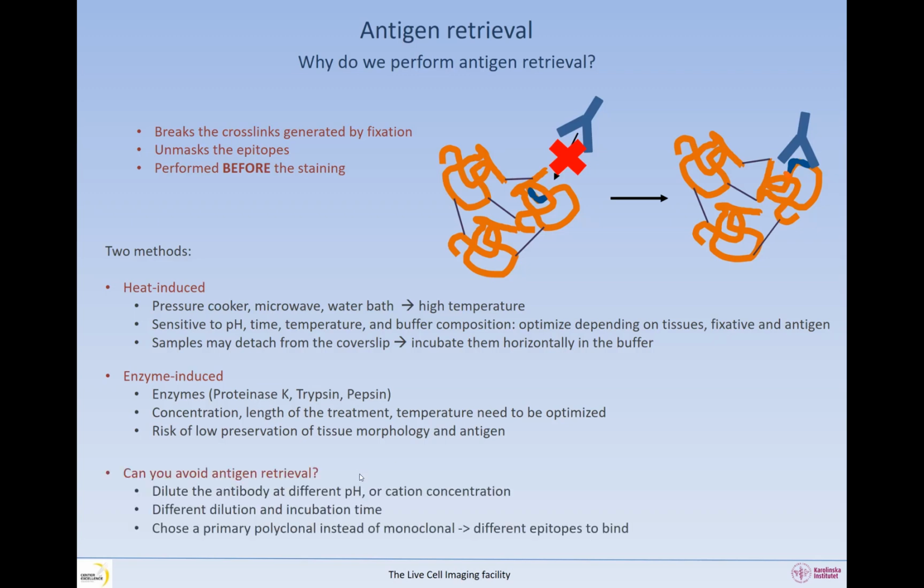Do you always need antigen retrieval? No, it's not written that you always need it. In most cases with paraffin-embedded sections they say you need it, but sometimes you don't have to do this harsh antigen retrieval method.